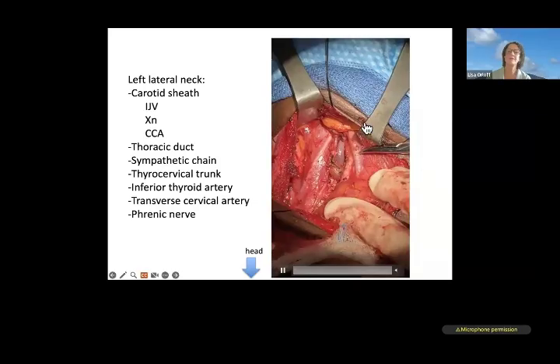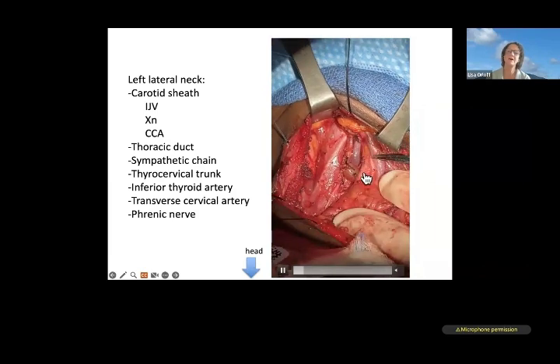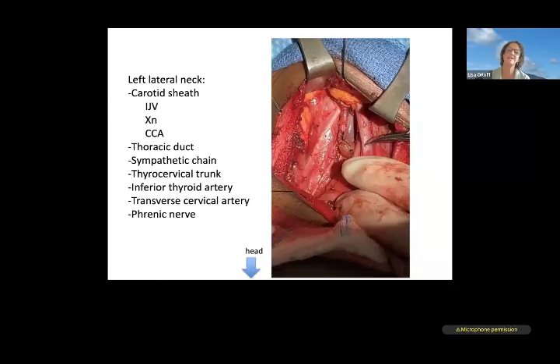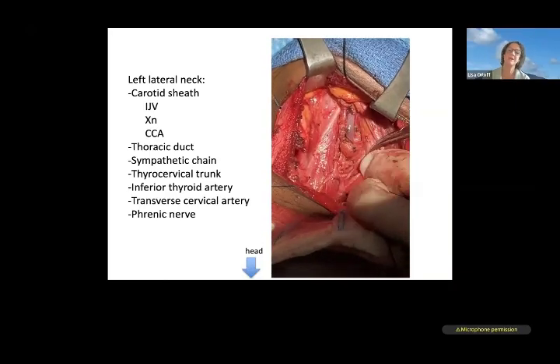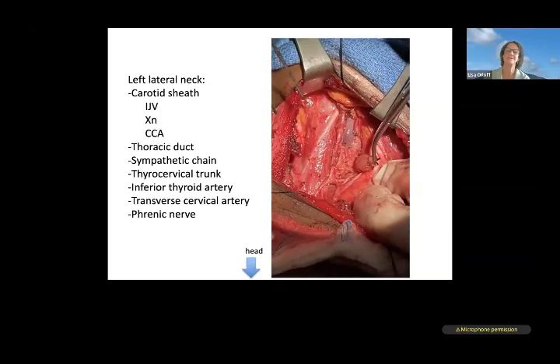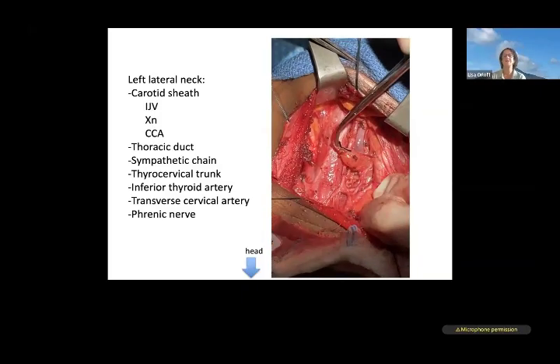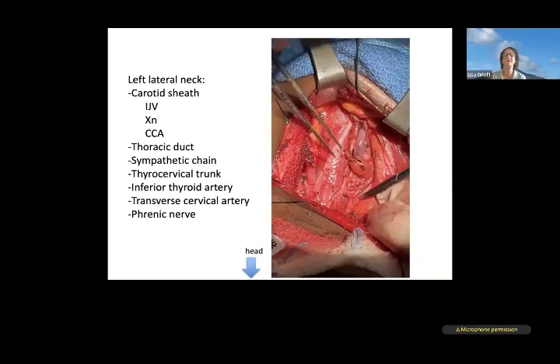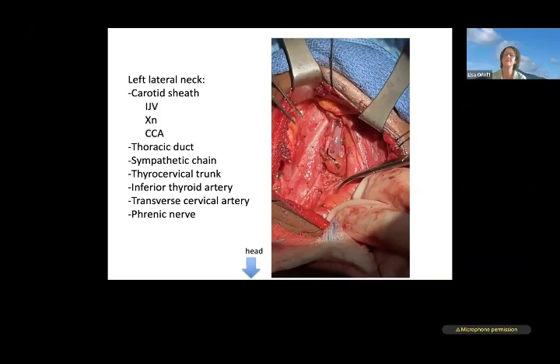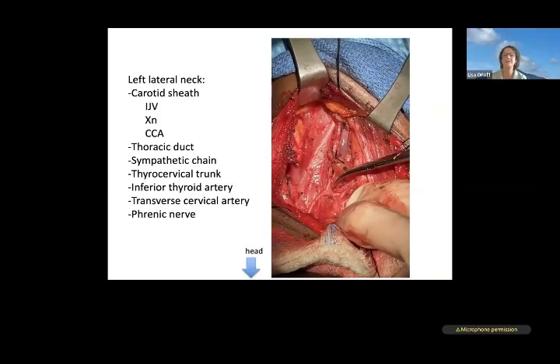Thanks. So this is just showing that the jugular vein has been dissected out, the vagus nerve behind it, and then you have the carotid behind that. And just rotating the carotid up, you have the sympathetic trunk and this very large lymphatic thoracic duct, which has been ligated. I ligate it when necessary, when it's draining nodes, and I test at the immediate time of ligation with Valsalva maneuver, because I think that's the best time to catch and treat any kind of chyle leak rather than waiting until the end of the case.